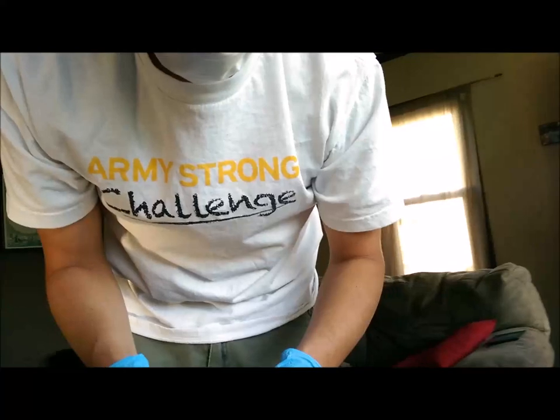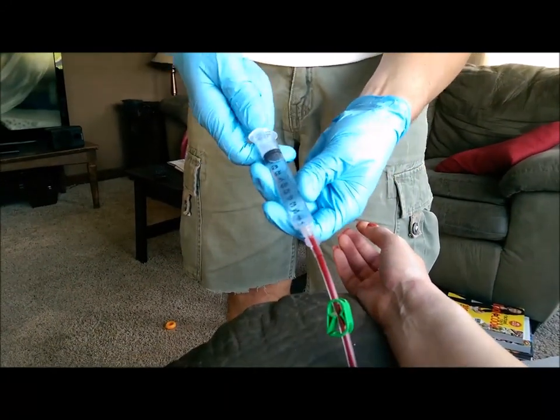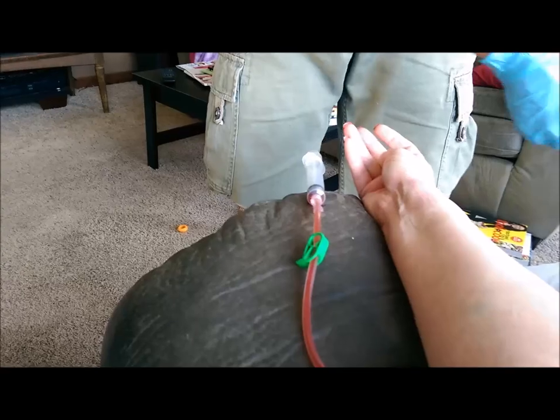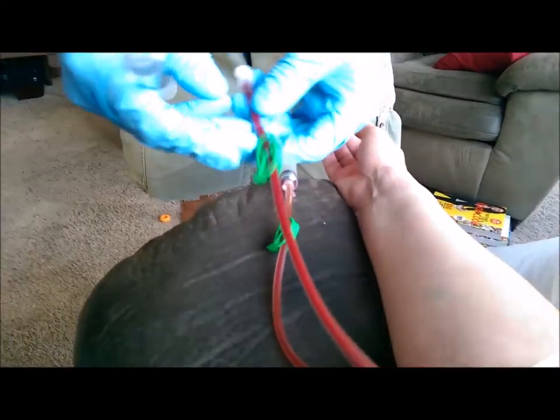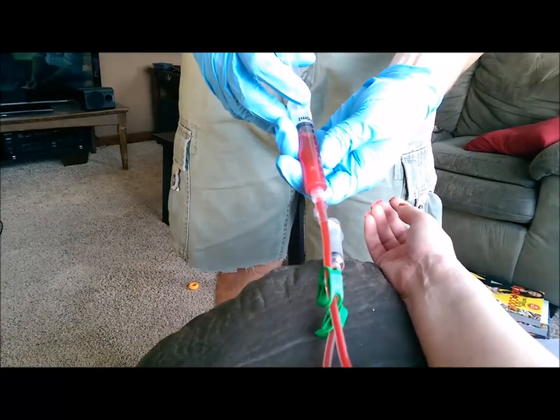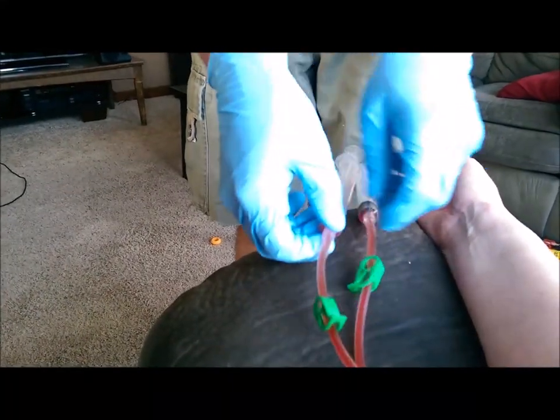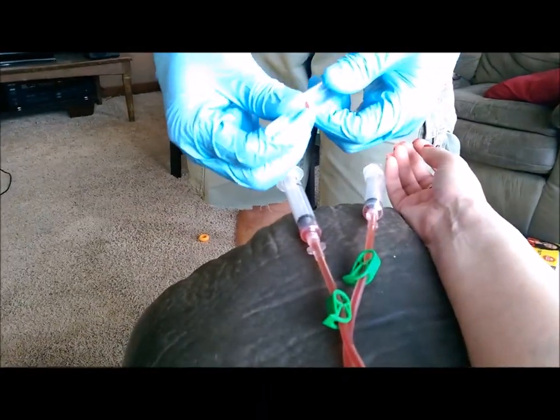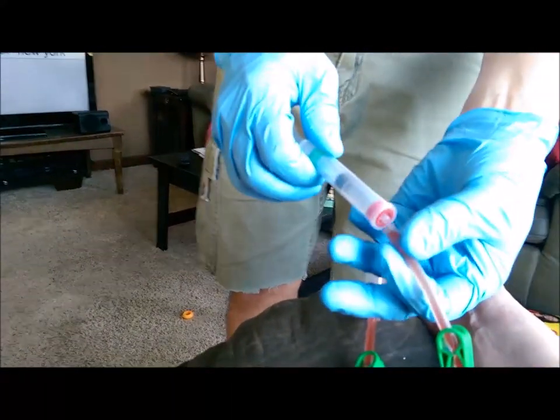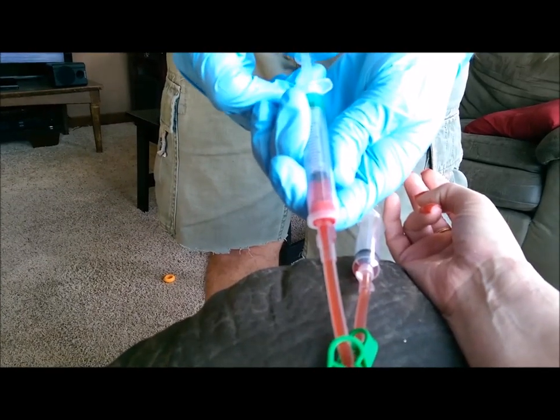Now I'm going to take the saline syringes we made before and flush each line to make sure it's open and flowing well — it goes right into her vein, then clamp it off. On the second line, I put a little blood in there to get any air bubbles at the end into the tube, because I don't want to push those air bubbles in. Now I'm going to take the heparin that Tammy prepared, unscrew the syringe, and replace it with the heparin. I'm going to draw some blood in and push it back out a couple of times so it mixes in with the blood.